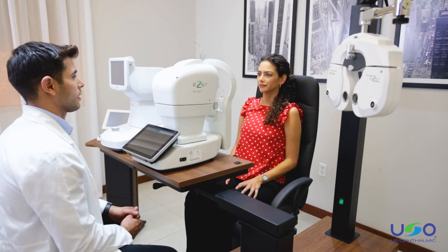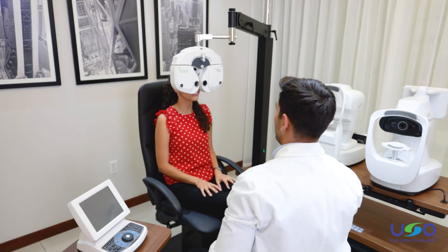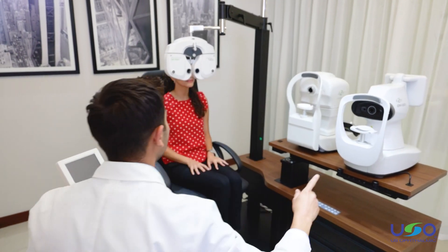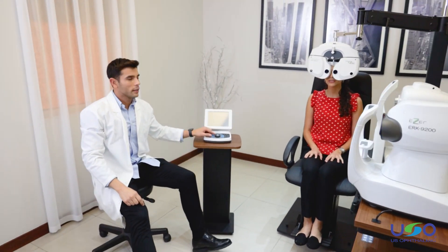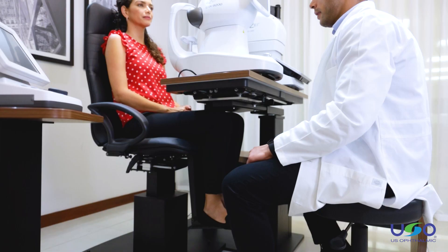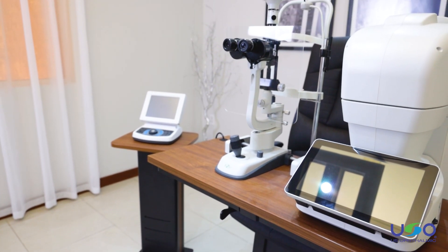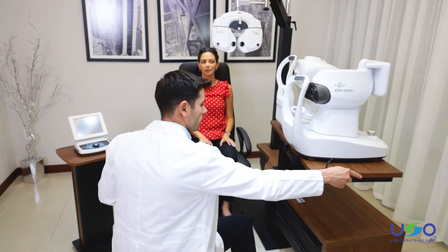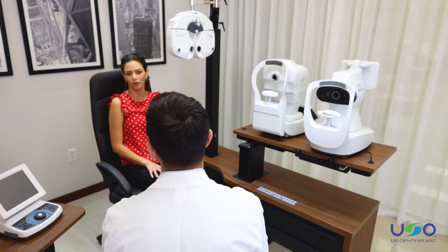The Venetia offers practicality for doctors, brings warmth to your practice, and allows your patients to fully relax during their exam. Our team can work with your designers and architects to adapt the Venetia to provide a stylish and unique look that matches your practice, elevates patients' experiences, and streamlines exams. Create a sophisticated, streamlined experience for your patients with Venetia in your practice.